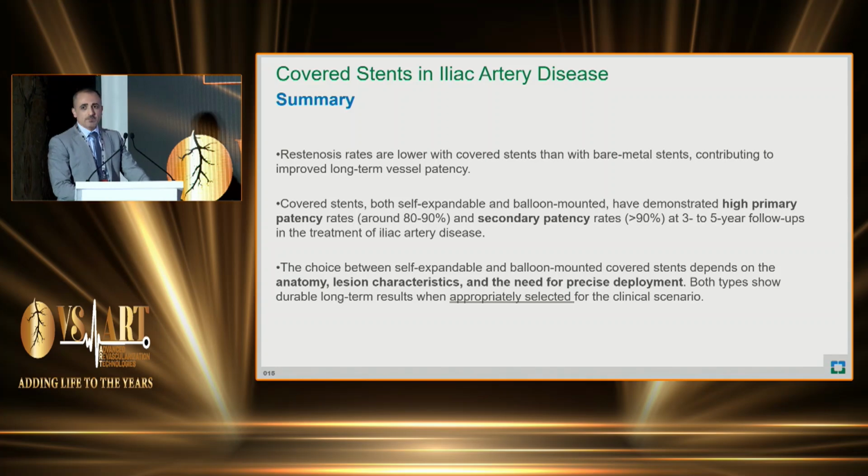But the most important message today, I think, is that the choice between self-expandable and balloon-expandable stents is a patient choice, which should depend on anatomy, lesion characteristics, and the need for precise deployment. And when the appropriate stent is selected for the right patient, usually they do well. I will illustrate that with two cases.